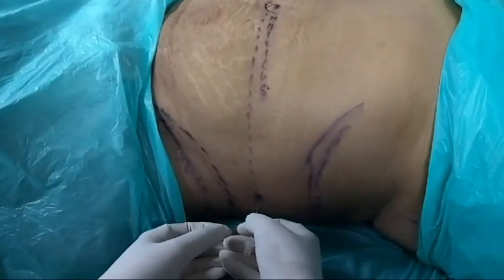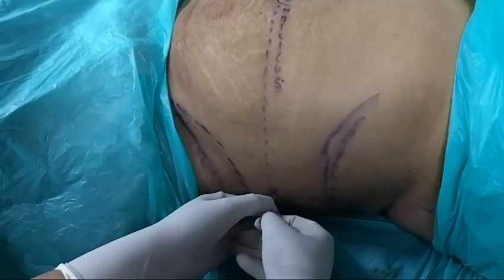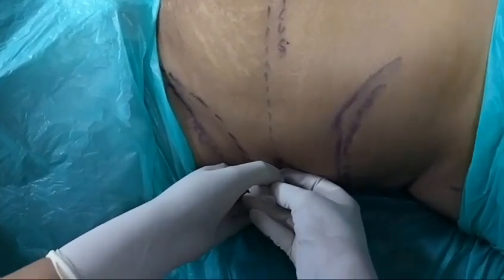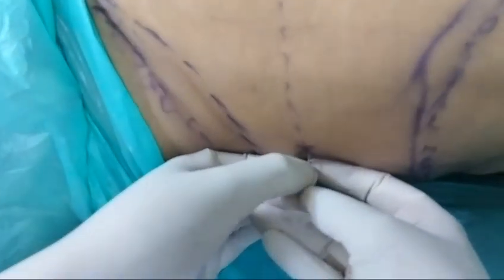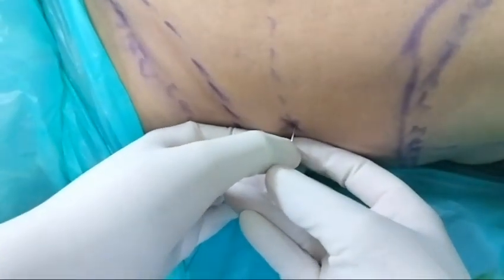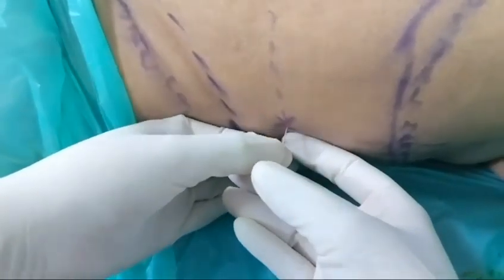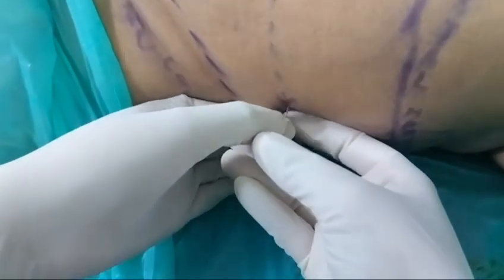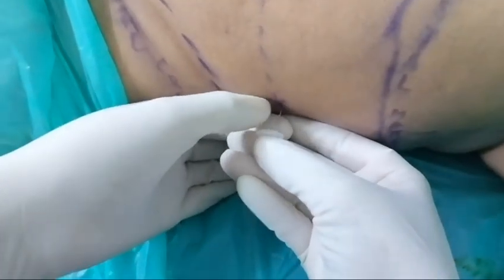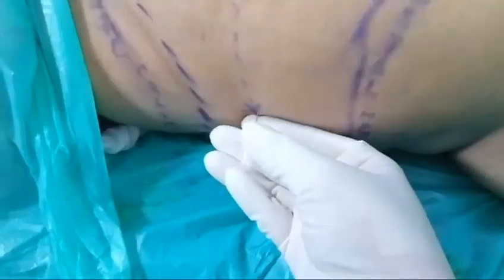Now we are starting with the block. We have injected the needle at the skin, going inside. This is the first pop-up, at the level of external oblique. Going inside, as we go inside, we get another pop at the level of internal oblique. Now we are in the plane between internal oblique and the transverse abdominis.